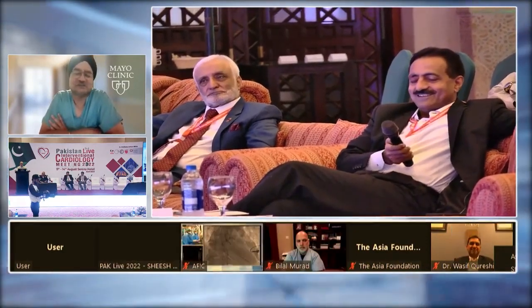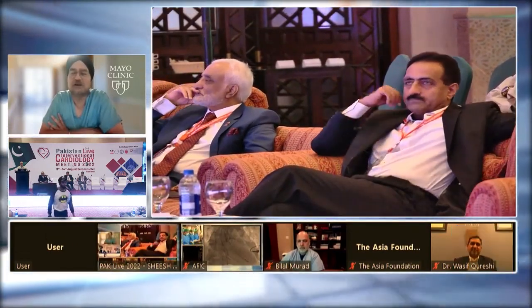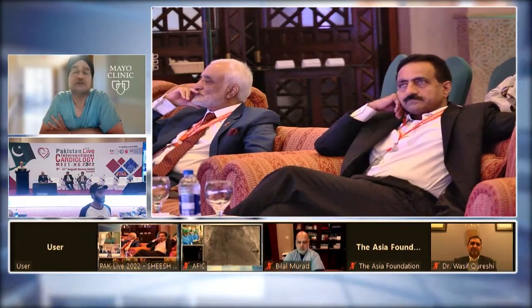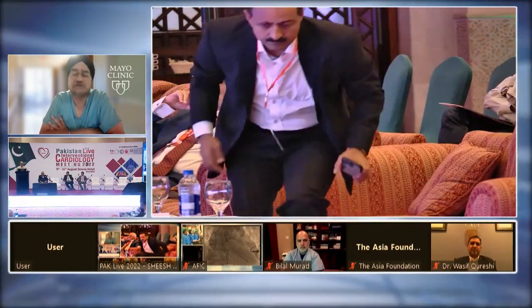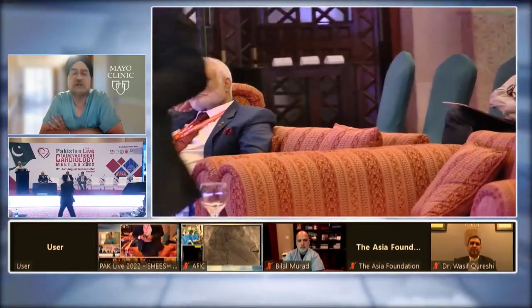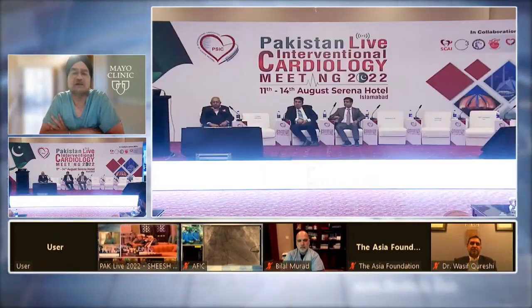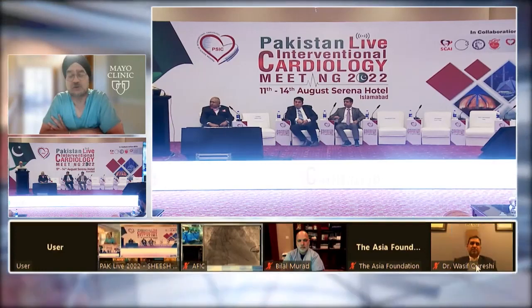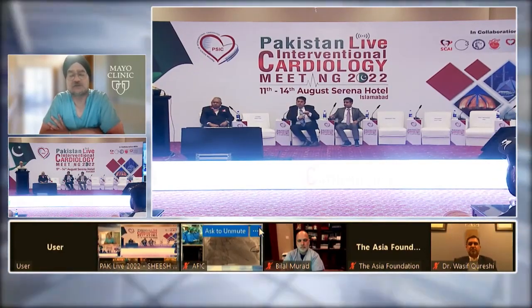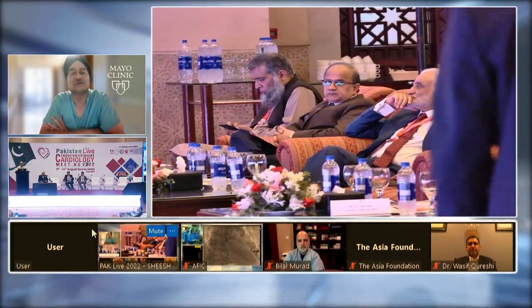This is a great question. The mitral valve is much more complex than the aortic valve, so I think it's going to take some years. All the valves that I have used and seen being used are much more challenging to get in than a TAVI valve is. The TAVI valves typically are quite straightforward for most cases, not all, but with transcutaneous mitral valve replacements, almost every case is a challenging case. So it's going to take some time.